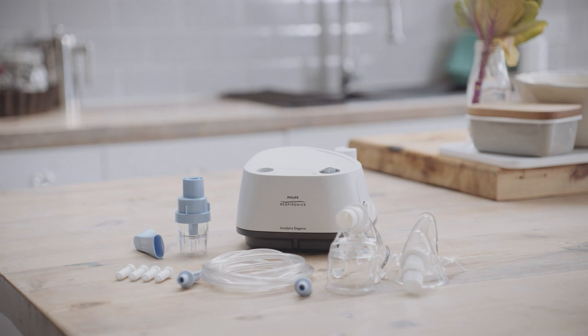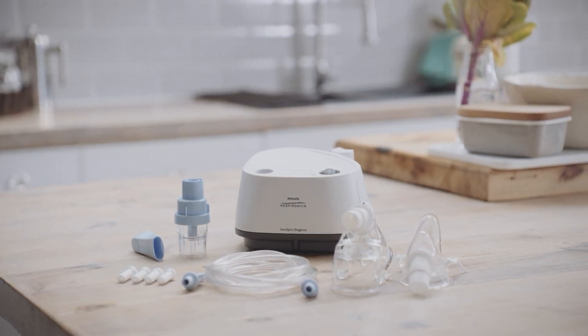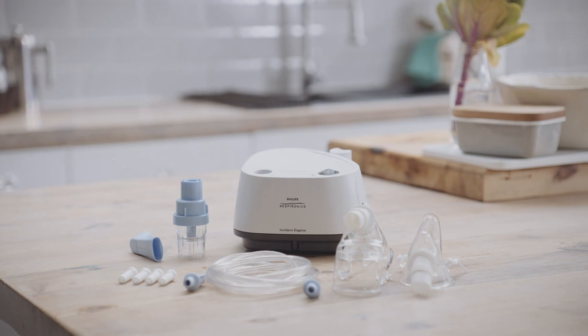It's important to carefully read the instructions for use before you use your Philips Inaspire Elegance Nebuliser Compressor for the first time.